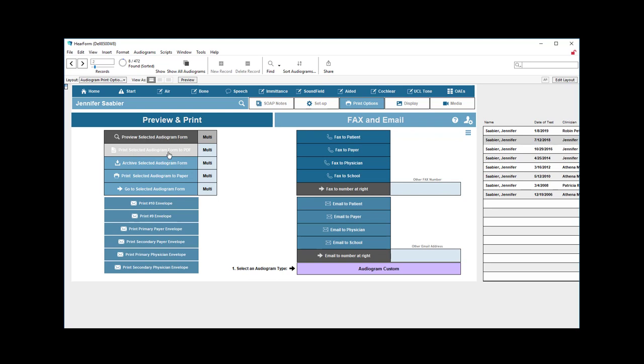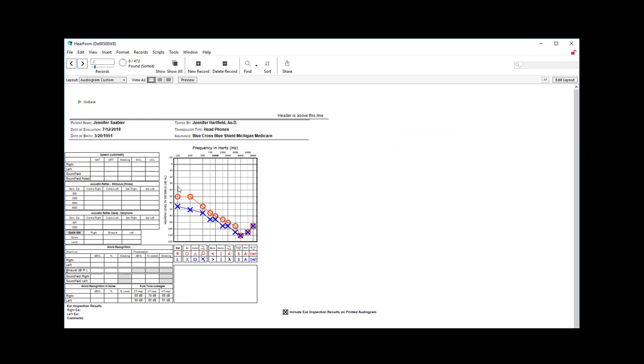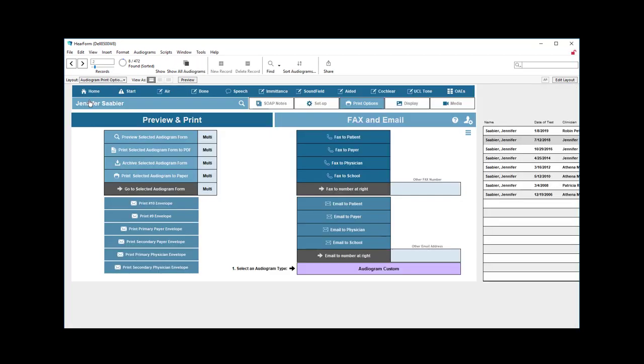Now you can also print to a PDF or multi, the multi-audiogram to a PDF, not the selected, but the multi one here. You can archive that, you can print it to paper, and perhaps hand that to the patient, or you can go to the selected form just like I've done here. When you're done looking at this, you can go back, and that brings us back to the screen that is for print options.